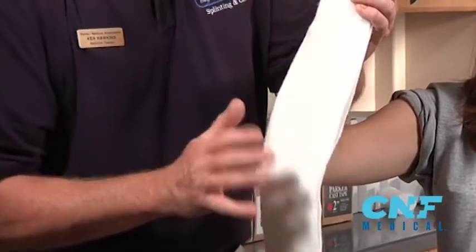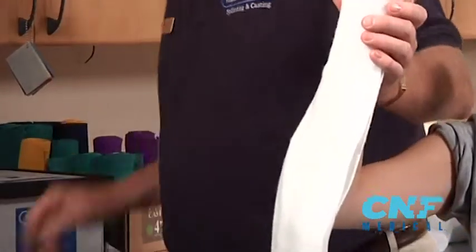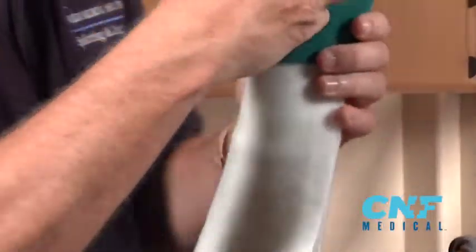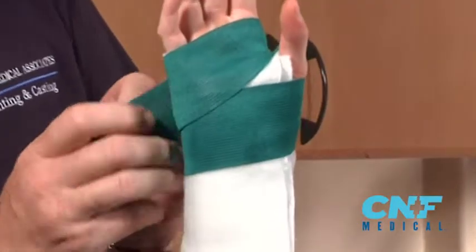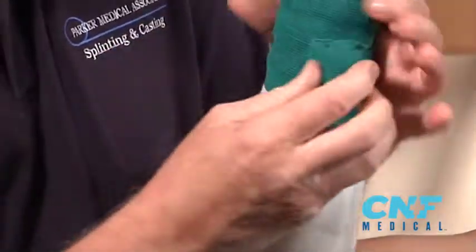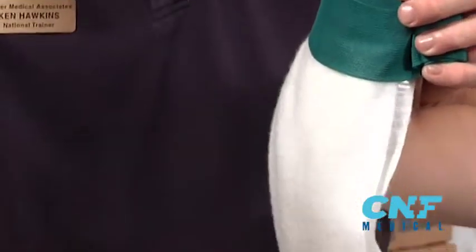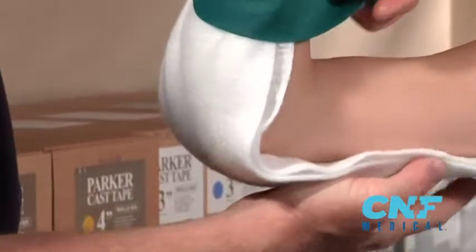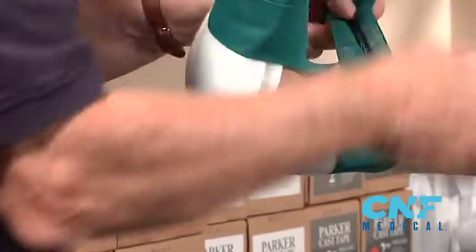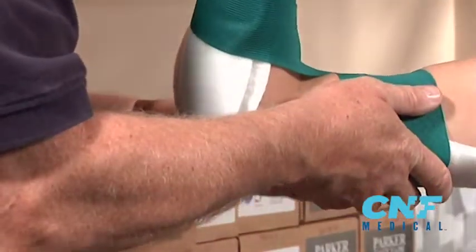Don't worry about this being up here — a lot of people get concerned with that. Just do the hand first. I'm going to use a two inch on her hand. Just come around once, through the web space, and now towards the elbow with 50-50 coverage. Now take the bandage and come down, bring this up, and capture that on the back with the bandage just to hold it up there. Then take the larger bandage.